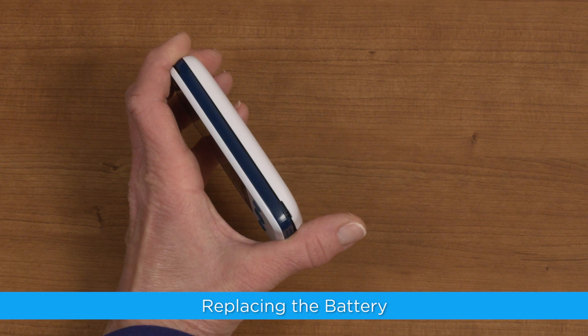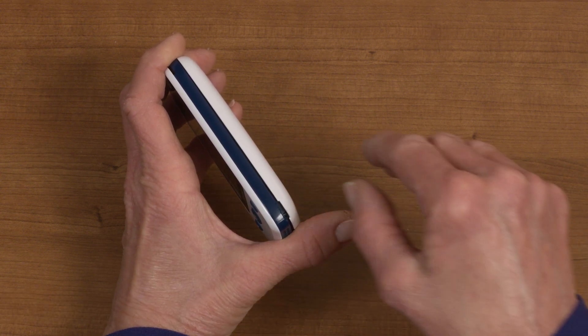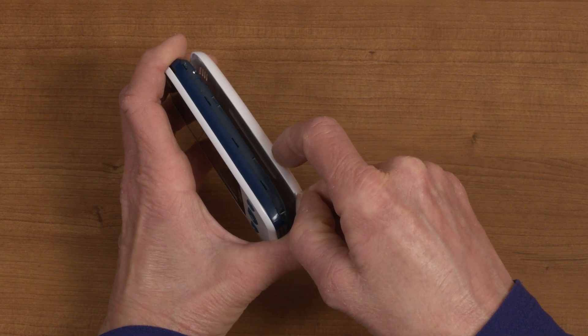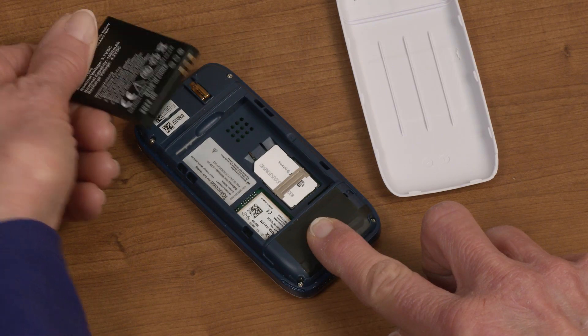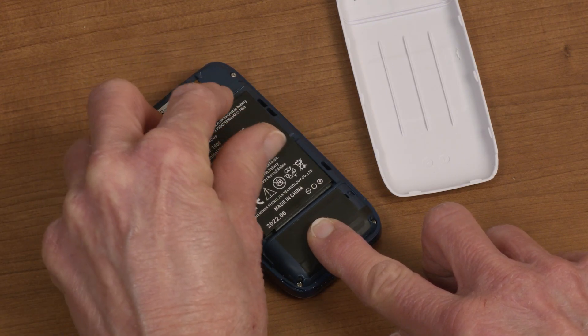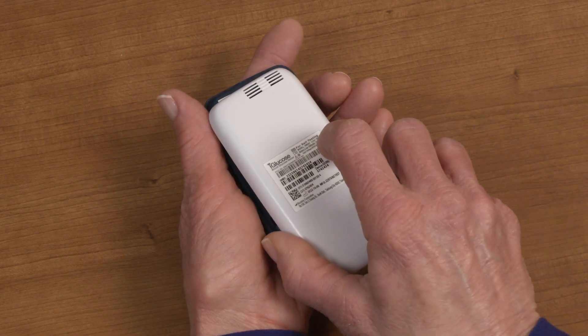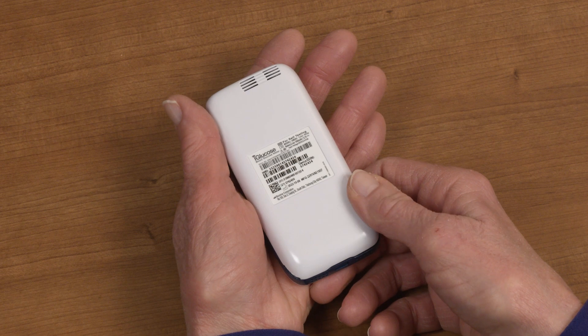To replace the battery, remove the back of your iGlucose meter by inserting your thumb into the small groove on the side of the meter near the bottom of the cover and lift up. Once the cover is off, you can replace the old battery with the new battery and replace the back cover. It should snap into place tightly. Be sure to fully charge the new battery before taking your next reading.